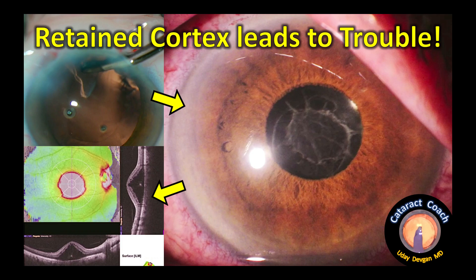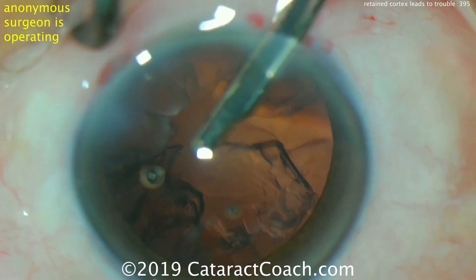Retained cortex leads to trouble, causing macular edema and decreased vision.